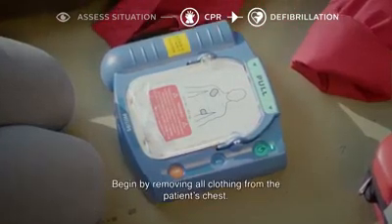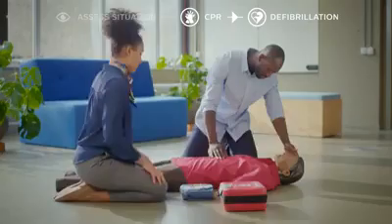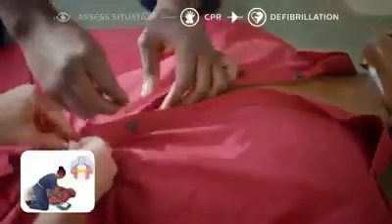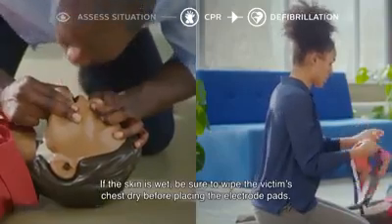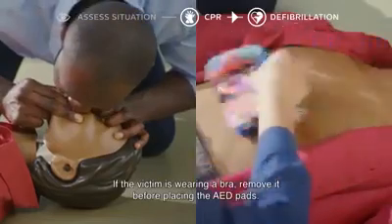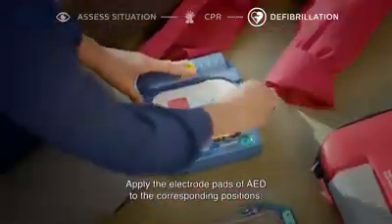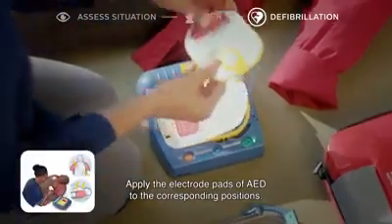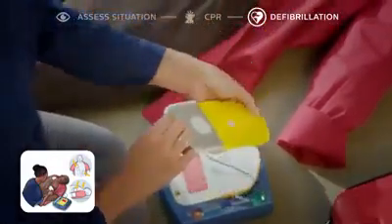Begin by removing all clothing from the patient's chest. Cut clothing if needed. If the skin is wet, be sure to wipe the victim's chest dry before placing the electrode pads. If the victim is wearing a bra, remove it before placing the AED pads. Apply the electrode pads of the AED to the corresponding positions. Plug in the connector if necessary.